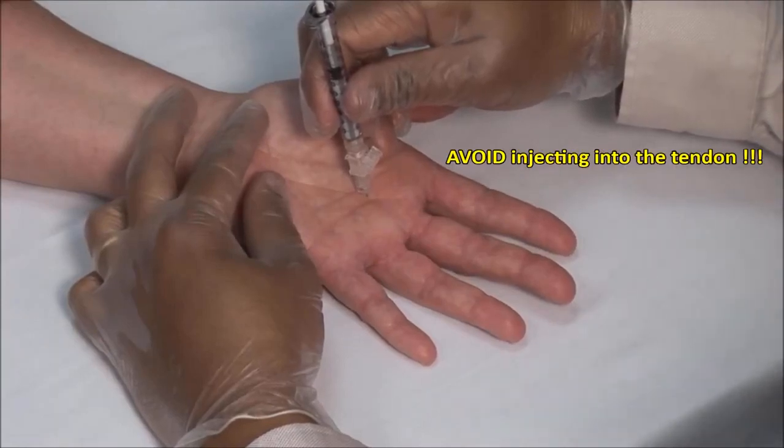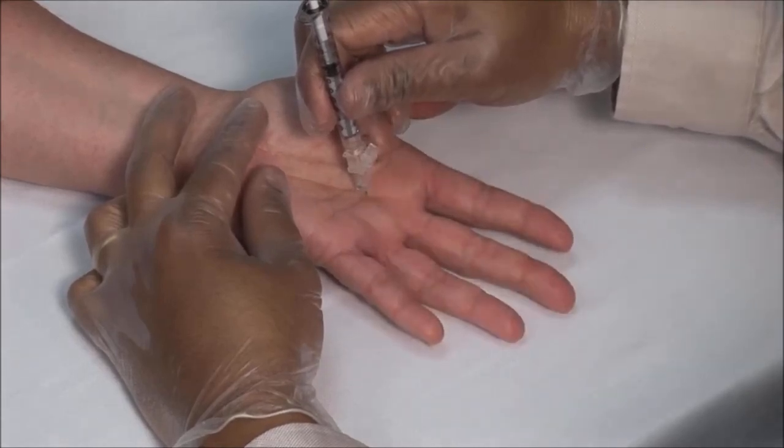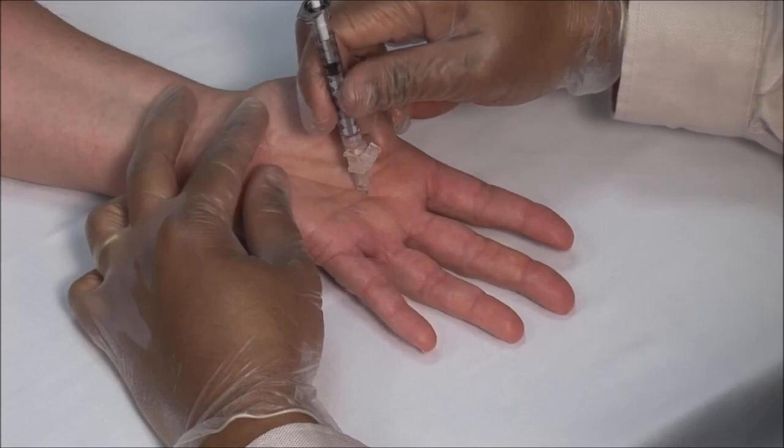You can ask the patient to flex and extend the finger. If the syringe moves then the needle is within the tendon and it should be withdrawn a little and repositioned.